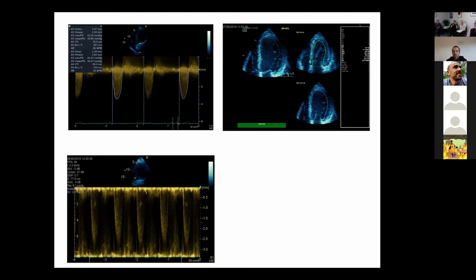Is this woman's dyspnea due to this? What do you think we will do? Has she got severe aortic stenosis? Because the 2D didn't really show it. But she's got these very high velocities. Well, how much of that is due to the high flow state? Because she's, what, 33 weeks? So if you thought that, what would you do? She's sitting in front of you, you've got to treat her. Well, it's abnormal, but some of that will be due to being in a high flow state. So if you're looking just at the peak velocity.